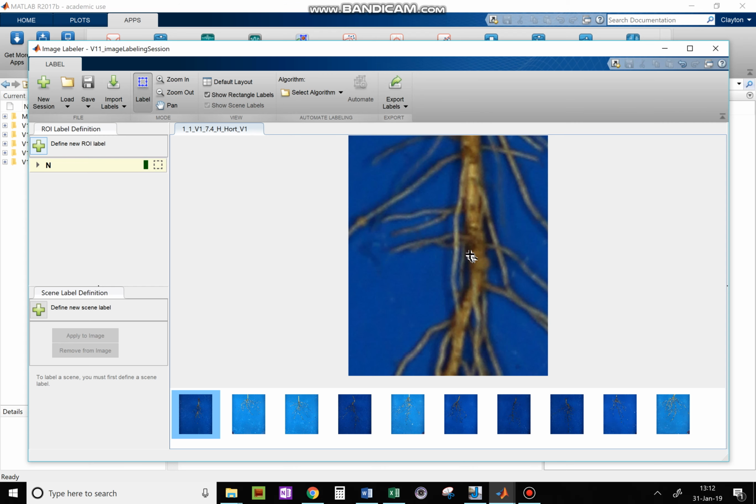When we're labeling, we don't want to get underneath the top of the nodule or off to the sides. So yes, my bounding box is around this nodule, but here at the top, it's not completely on the top of the nodule. And here on the side, I've got a lot of open blank space that's not actually nodule. So it's really important that we get it on the real nodule itself. I'm going to move it and bring these bounding lines in so that they fit the actual nodule there. This one I'm going to take just a little bit more up there. There we go. So that's actually bounding the entire nodule itself.